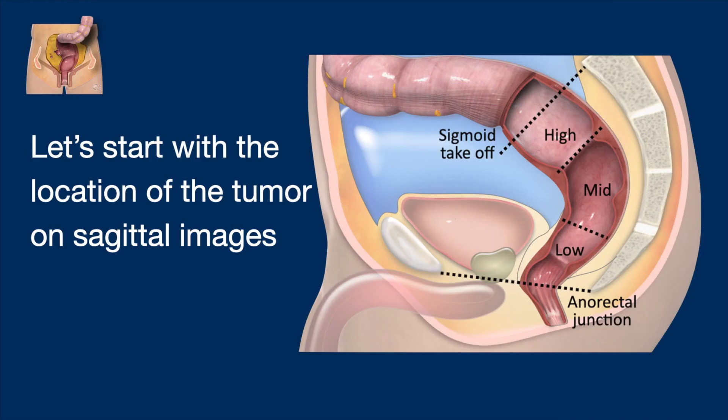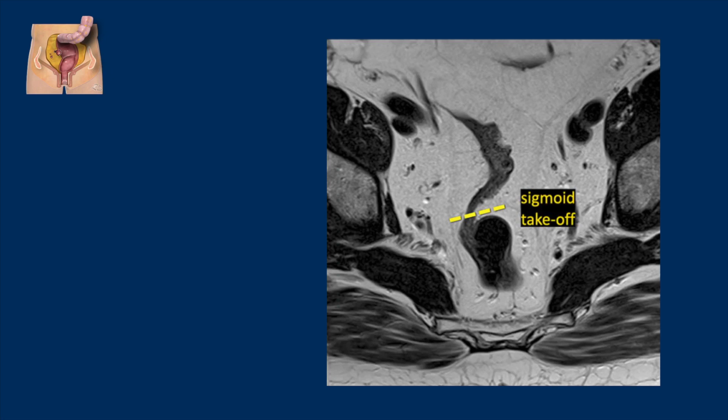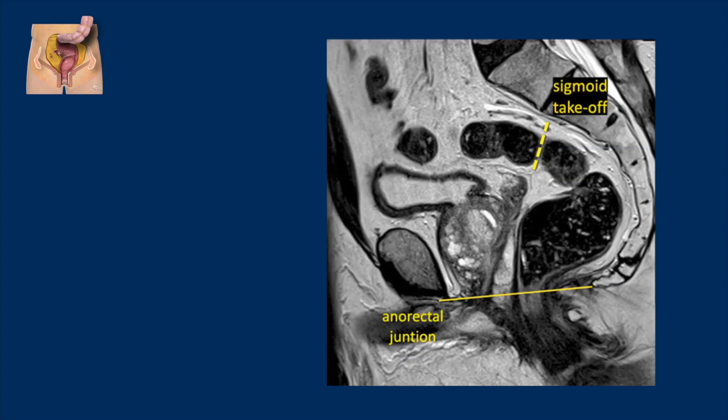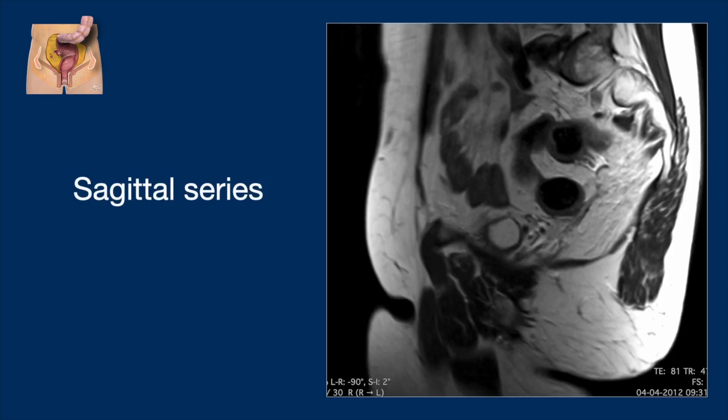Let's start with the location of the tumor on sagittal images. The rectum starts at the sigmoid takeoff and ends at the anorectal junction. On axial images the sigmoid takeoff can be seen here, and on sagittal images it's where the sigmoid takes its horizontal course away from the sacrum. Now let's start with the sagittal series.